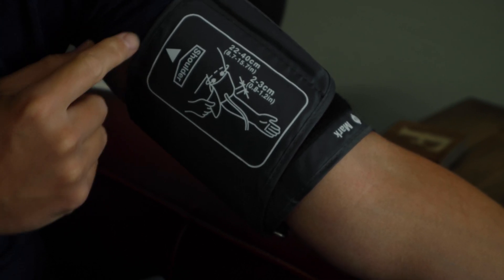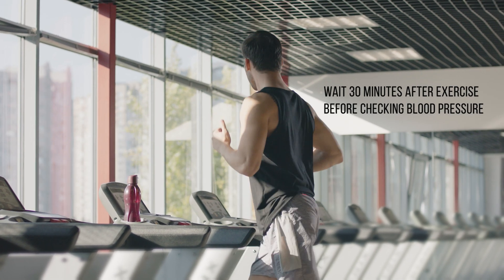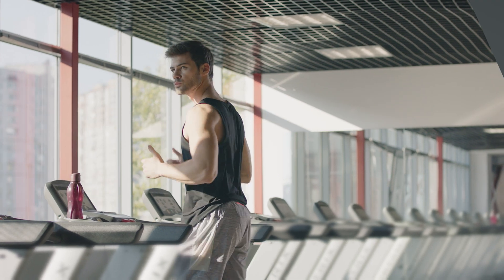It's best to place the cuff directly onto your skin for the most accurate reading, so wear a short sleeve shirt or one that you can roll up without restricting your arm too much. The cuff should be snug around your arm but not too tight. Also remember it's not good to check your blood pressure within 20 to 30 minutes after exercise because it could be elevated.